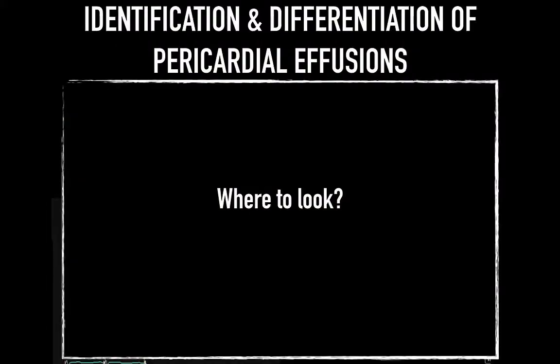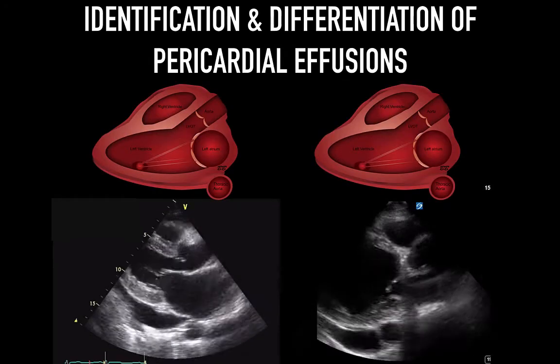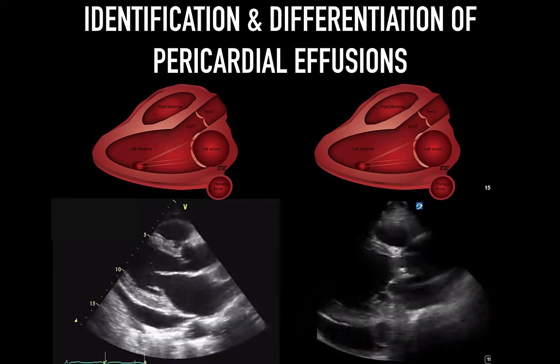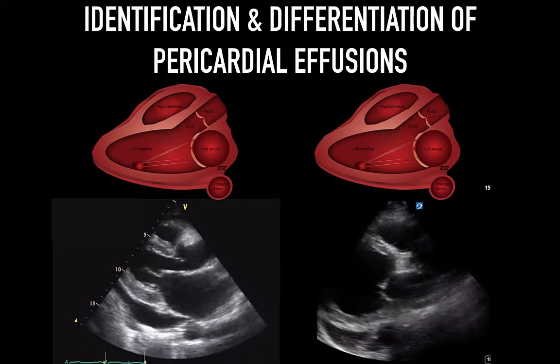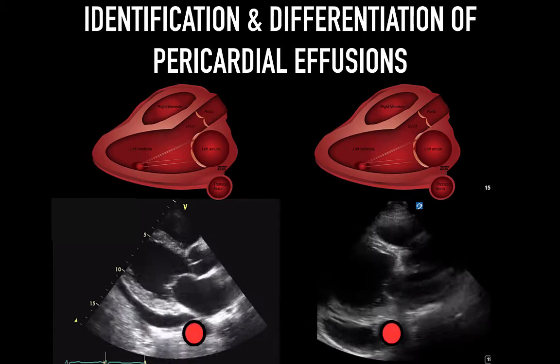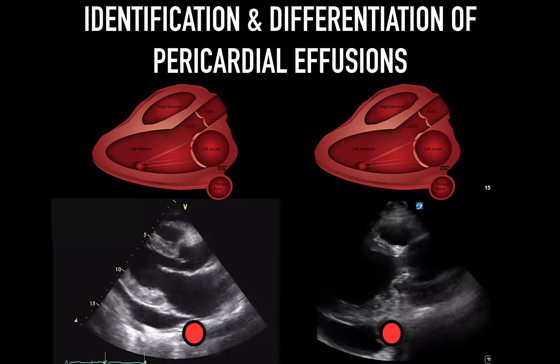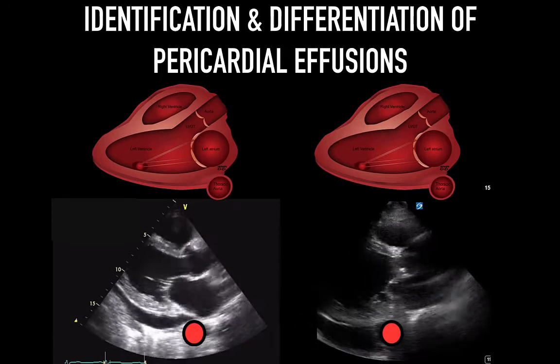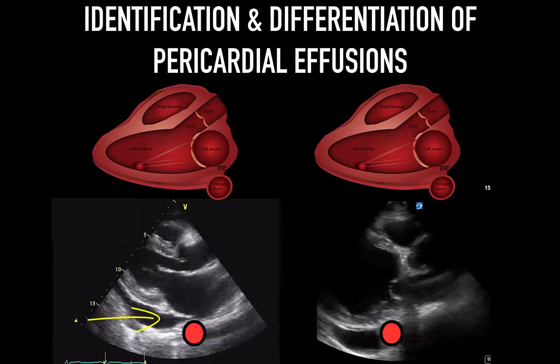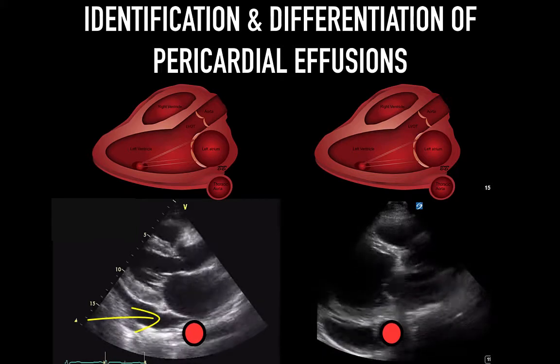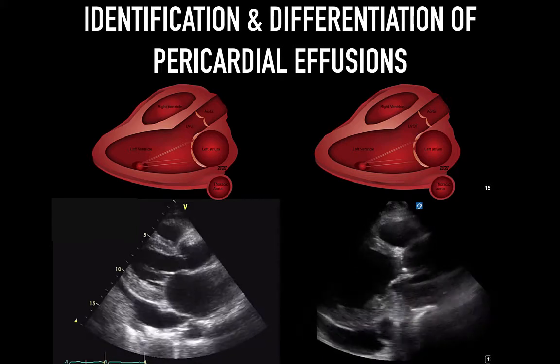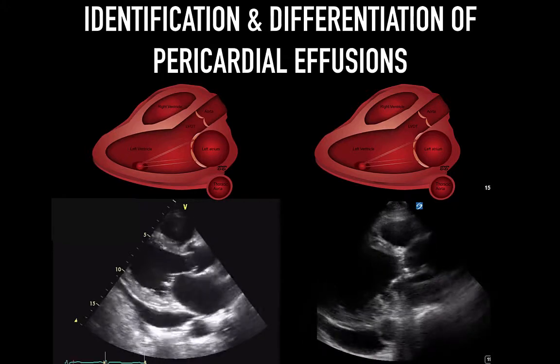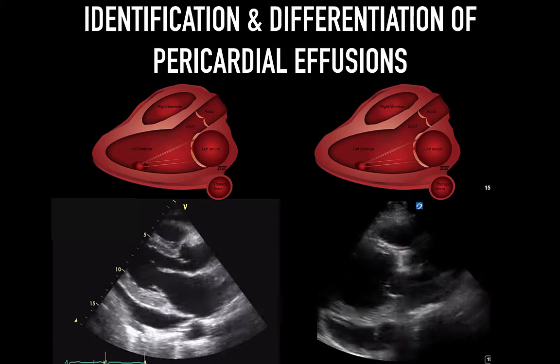The most common view where they can be mistaken is the parasternal long axis view. In this view, the left pleural space can appear to mimic a pericardial effusion inferior or posterior to the heart. The landmark is the aorta, which is outside the pericardium and passes just posterior to the left atrium. Thus, a significant pericardial effusion will appear like a wedge between the LA and the aorta, like the clip on the left. A pleural effusion will generally appear like a square shape abutting the aorta and won't slide itself in between the aorta and the left atrium.